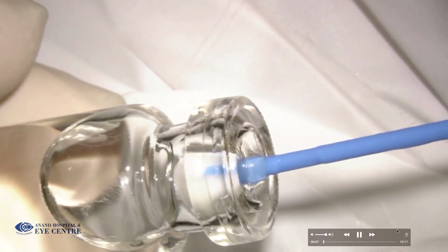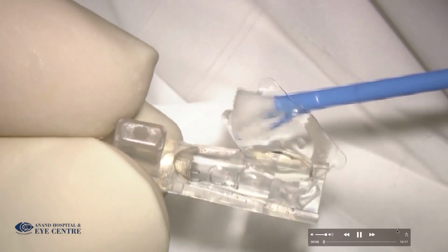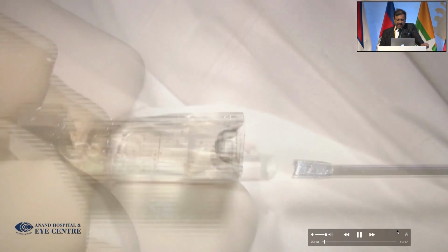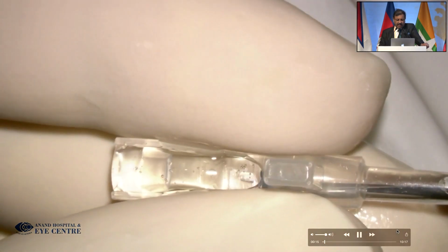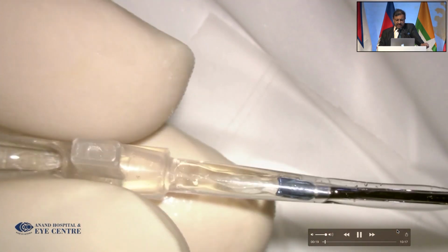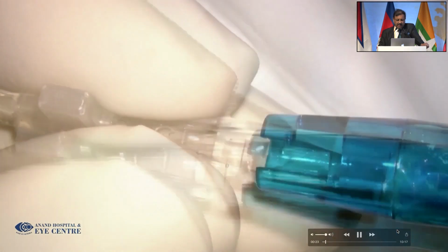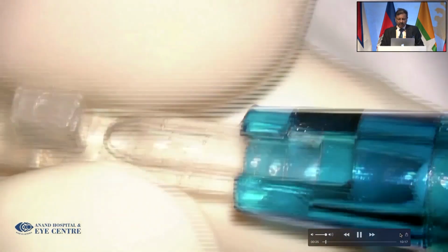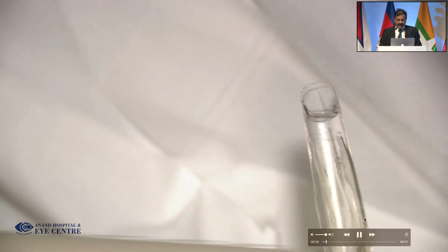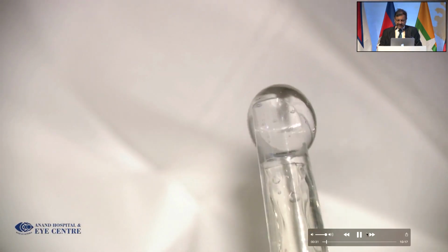So this is actually what loading to me is. This sponge, I never take any metallic instrument while taking this ICL out of the bottle and putting it inside the cartridge. This is the reverse as against the IOL that we load. And be careful that the 3 holes that you see have to be in line while you are pushing the lens inside the eye.